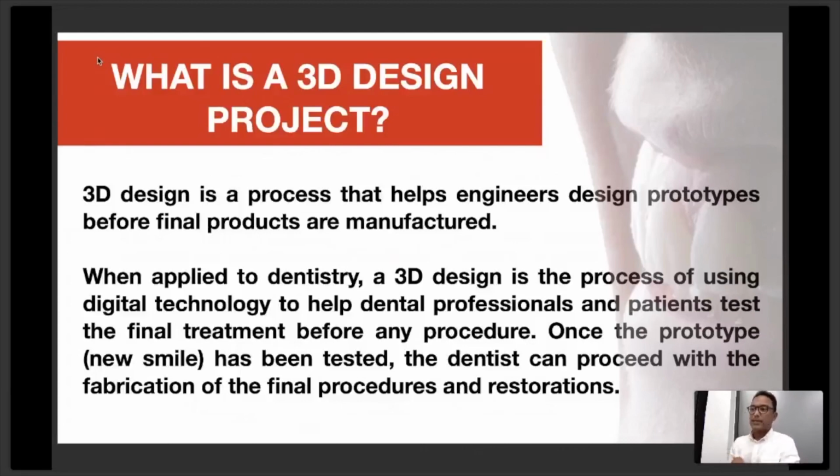And when it's applied to dentistry, a 3D design is a process of using digital technology to help dental professionals and patients test the final treatment before any procedures. Once the prototype, which is the new smile, has been tested, then the dentist can proceed with the fabrication of the final procedures and restorations.